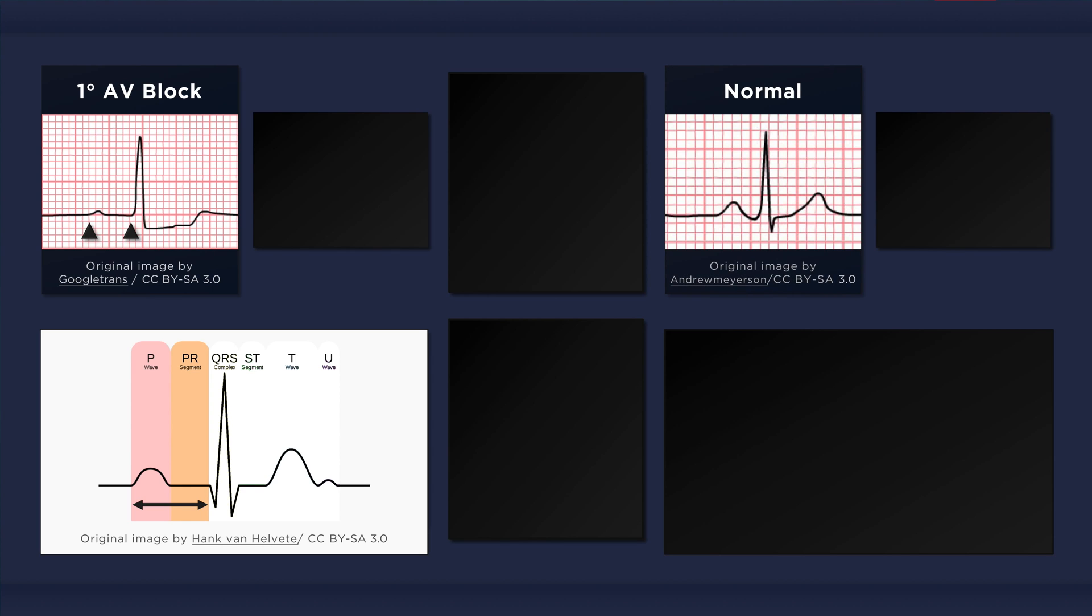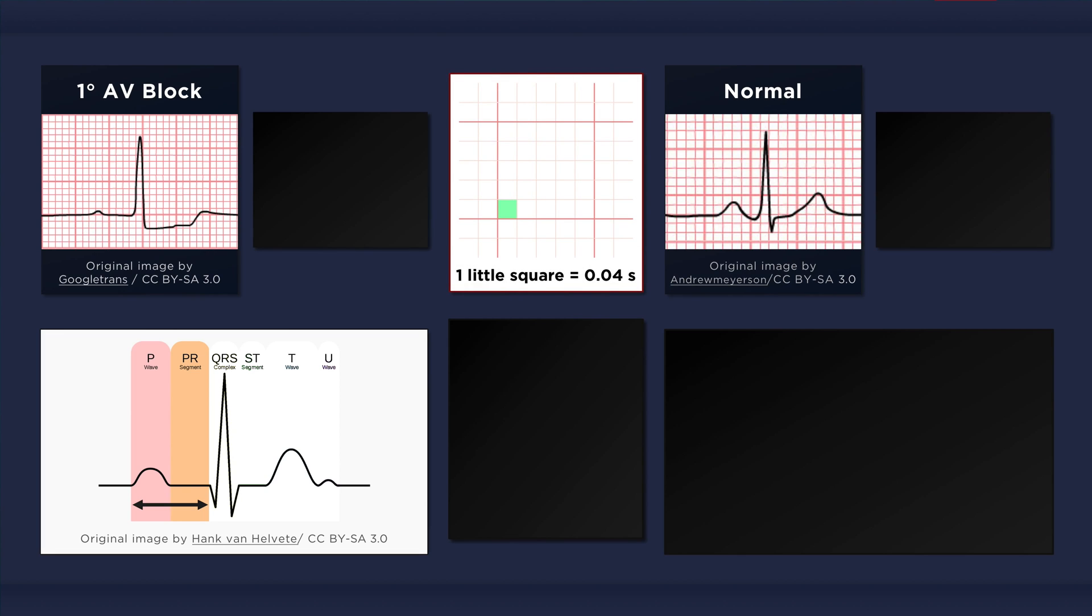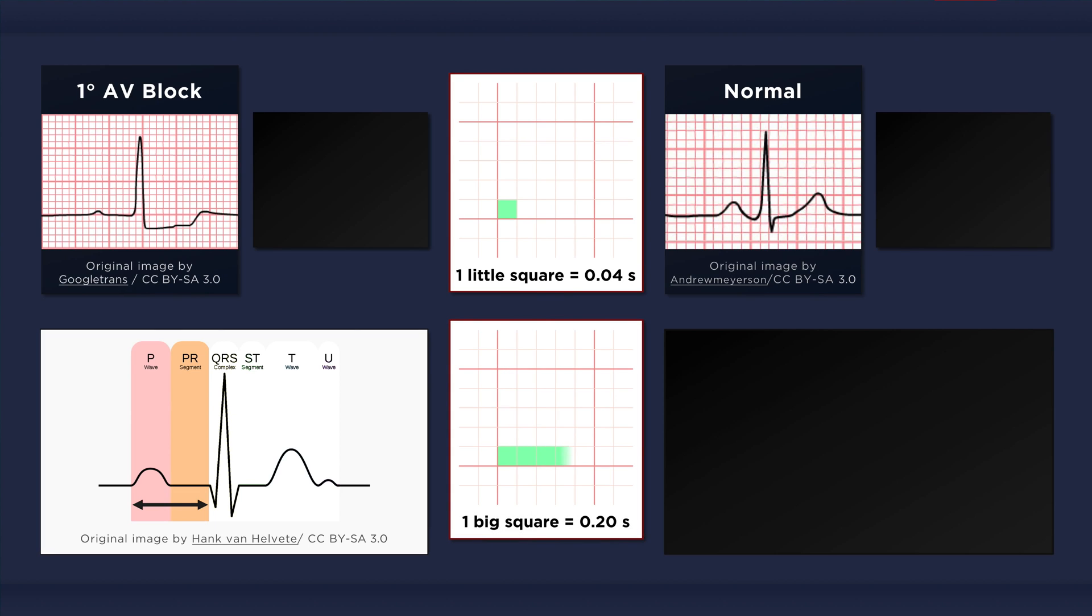The ECG on the top right depicts a normal PR interval. To determine its duration, we simply count the squares from the beginning of the P wave to the start of the QRS complex. The duration of one little square is 0.04 seconds, or 40 milliseconds. The duration of one big square is 0.2 seconds, or 200 milliseconds.